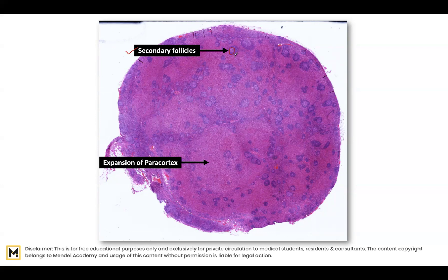What you see here is a dark area made up of the mantle zone and then a central pale area, which is an activated germinal center made up of B cells. The mantle zone consists of non-activated B cells. You can also see a few primary follicles here and there, where there is no pale central area. The way to recognize a secondary follicle is by identifying the germinal center within a lymphoid follicle.